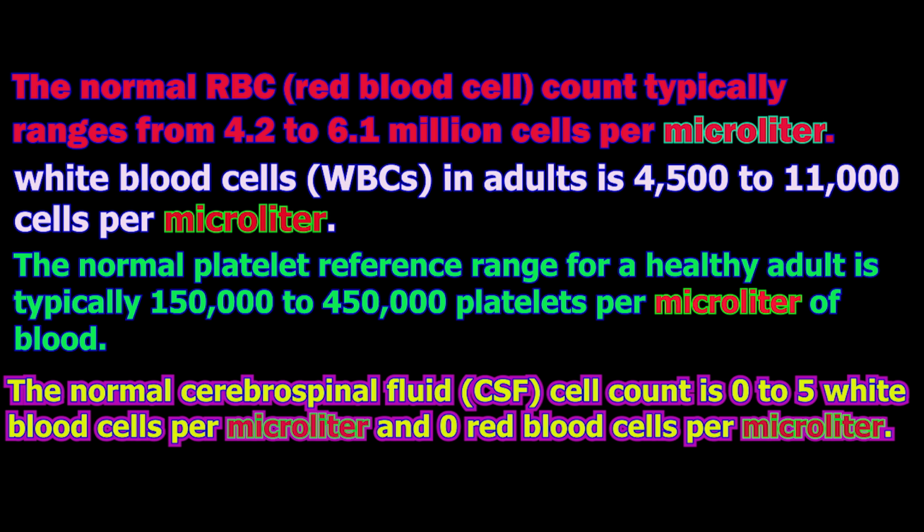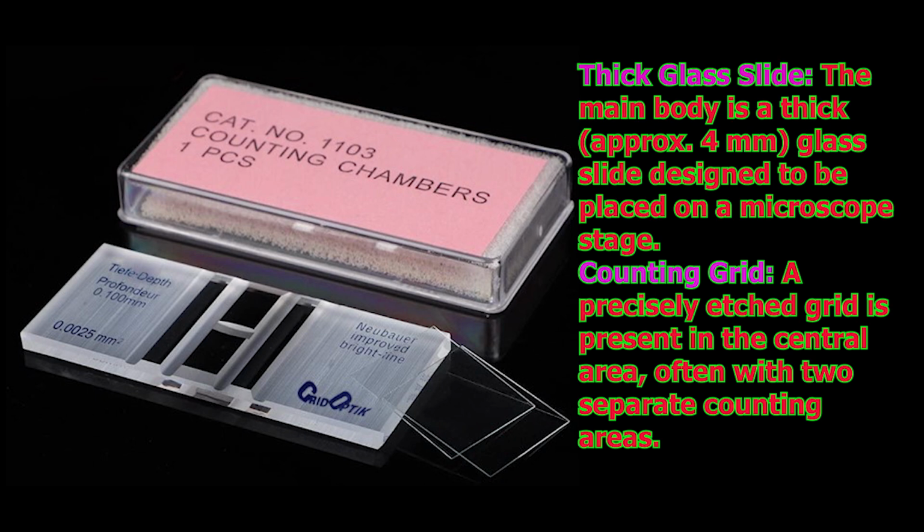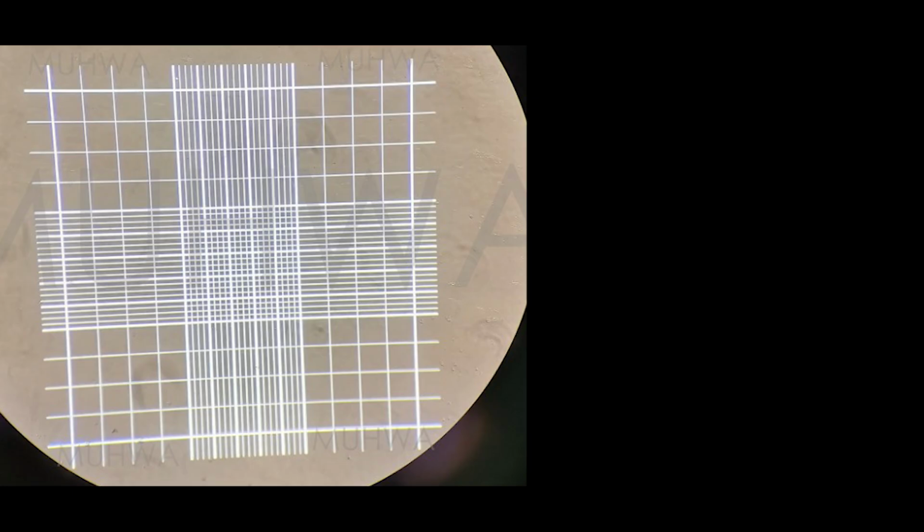Both are same. But the number of RBCs are in millions, the WBCs are thousands, platelets are in lakhs, and other body fluids like CSF are below 10 in normal conditions. Using the same counting chamber for counting few to some millions is made possible by making dilutions and the counting area adjustments. The calculations are made with the dilution factors and the area counted for each type of cell count.